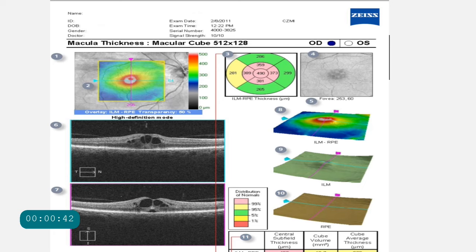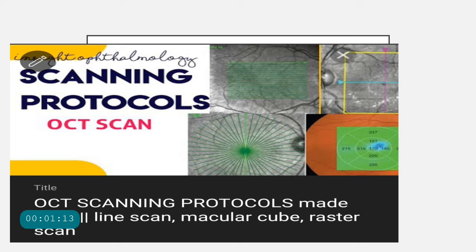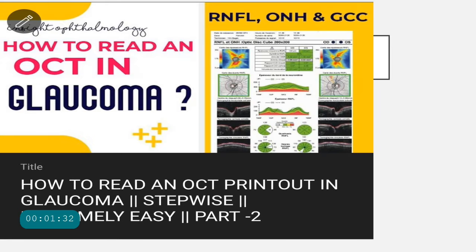We shall be studying the Cirrus OCT by Zeiss. Under the heading of macular OCT specifically, the most important protocol that we study is the macular thickness protocol, also called the macular cube 512 x 128. Similarly, we shall be studying the various line scanning protocols of the Cirrus, whether it is the five-line raster or a 20-line raster, which is converted into a high-definition line scan. If you're not clear about the various scanning protocols, I would advise you to watch my video on scanning protocols in the OCT scan. There are also other protocols specific to glaucoma — the RNFL, the optic nerve head, and the GCC related protocols — which are covered in the video on how to read an OCT printout in glaucoma stepwise.